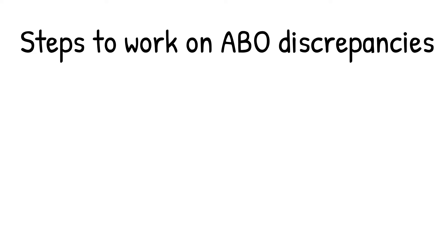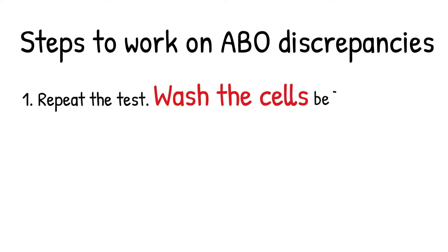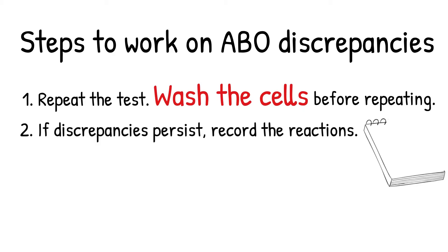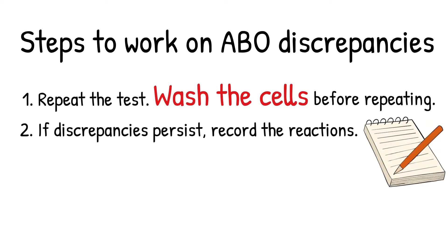Here are some steps to work on ABO discrepancy problems. First, repeat the forward and reverse type. Do not forget to wash the cells before repeating the forward typing. If the discrepancy goes away, you can report the results. Second, if the discrepancy persists, record the reactions — whatever you got — and continue to the next step.